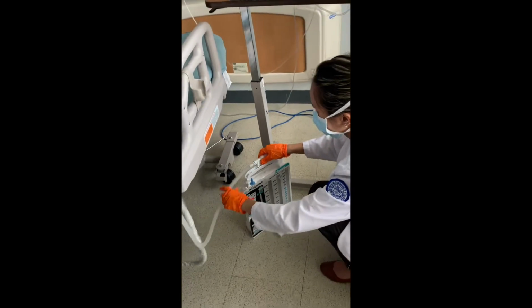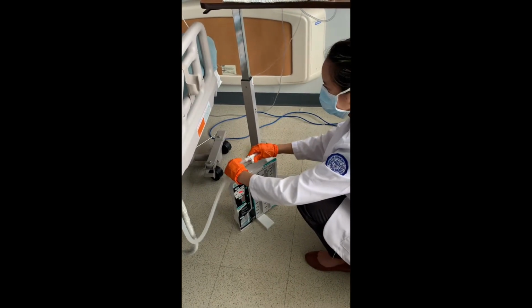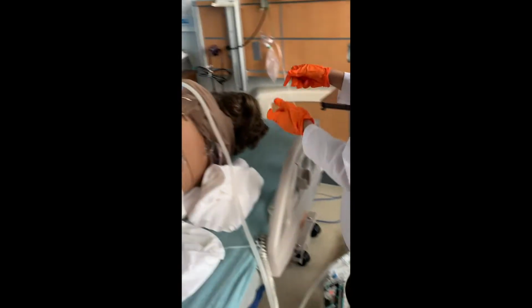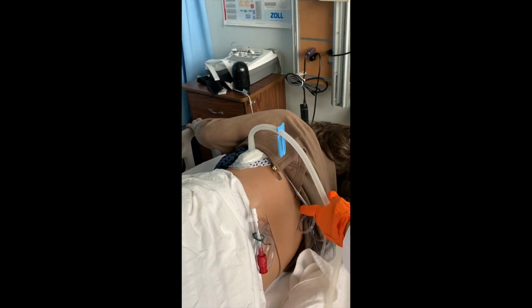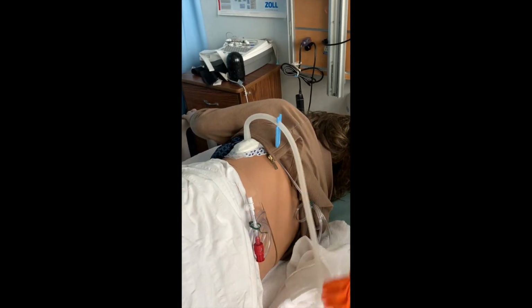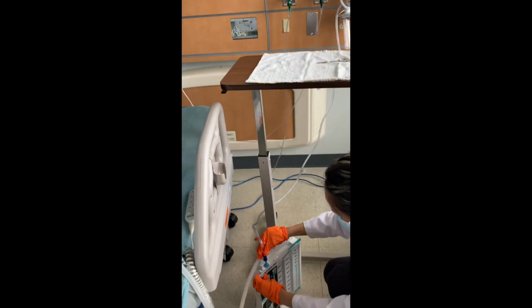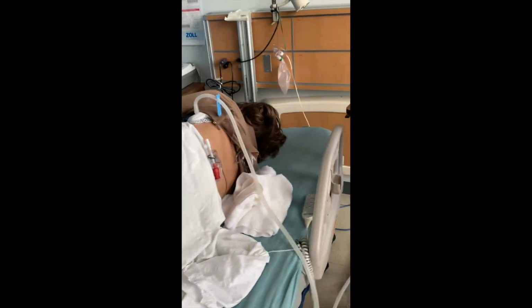Tape the connection to ensure it stays secured. Remove the clamps. Remove suction from the old system and connect it to the new system. Dispose of the old system.